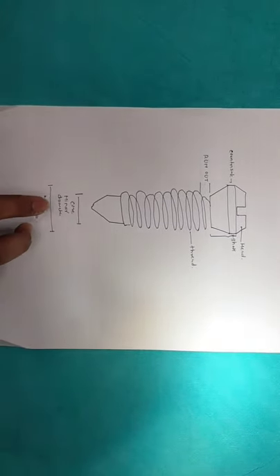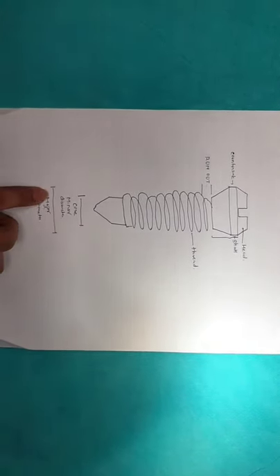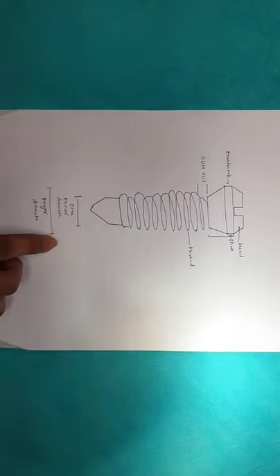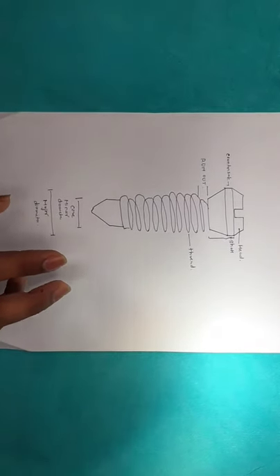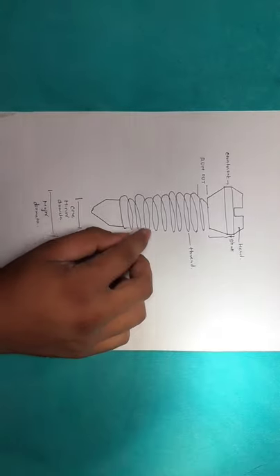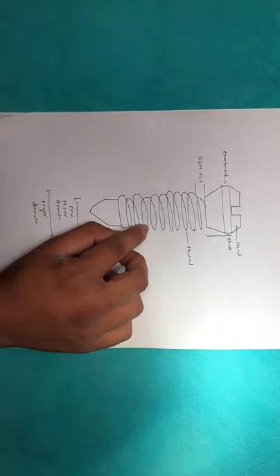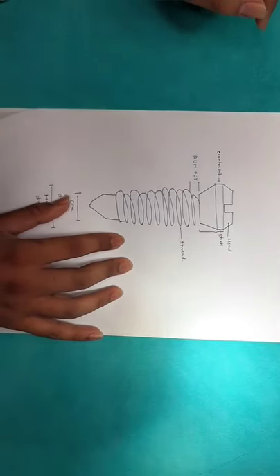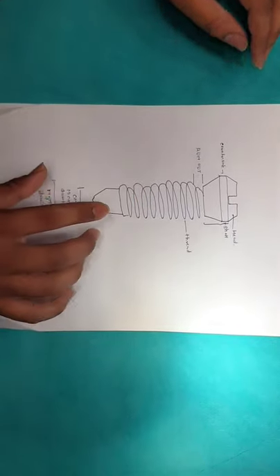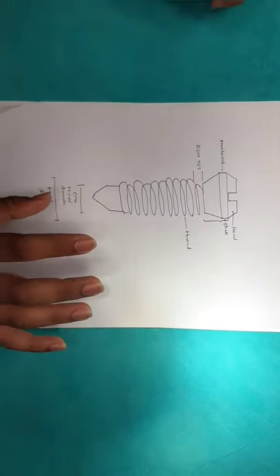The thread has two diameters: this is the core diameter and this is the major diameter. Now we are discussing pitch. What is pitch? Pitch means the distance between these two threads. What is lead? Lead means the distance it travels on each turn. Hence, the pitch is equal to the lead.